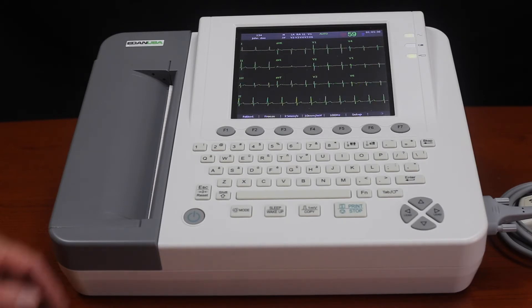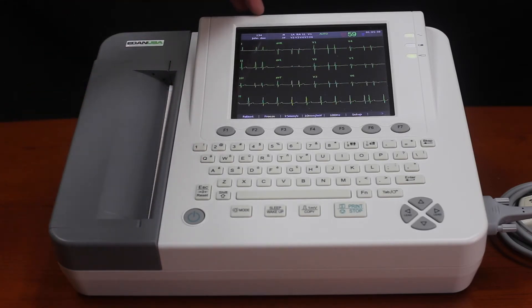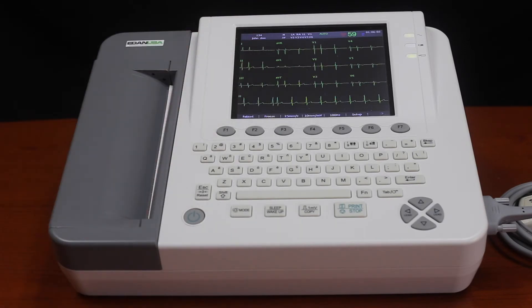Also included on here is interpretation software, so it will interpret the EKG for you. We have already input some patient information, so it does have the name right across the top. You do not have to put the patient information into the machine to do a quick EKG — you can just hook them up and it'll show on the screen.